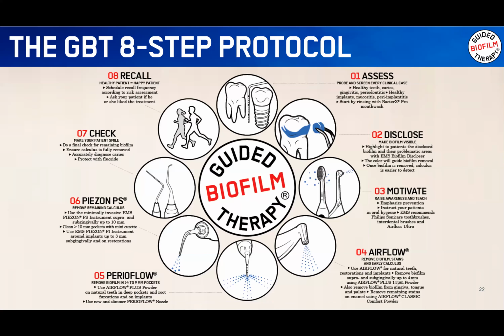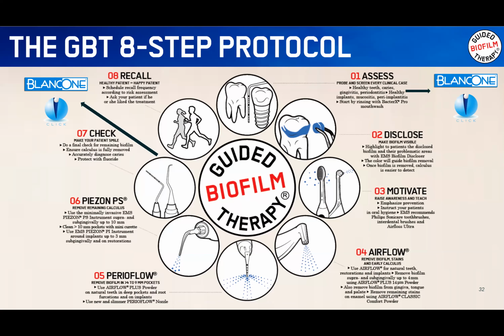So where I use the click now in this protocol, normally I talk about it in the assessment, because this is the moment that we are asking the patients for health problems, but we are also asking the patients about their expectations of the treatment, what they want to get as a result. But also it's the step where we're going to see if there's fractures, if there's periodontal disease, and we can see the color of the teeth too.